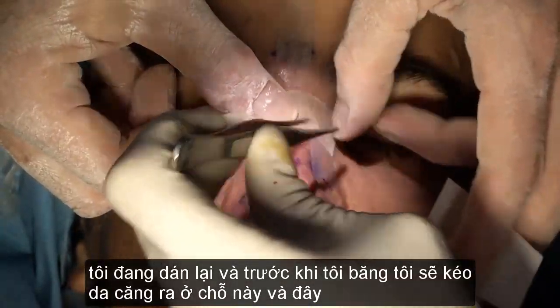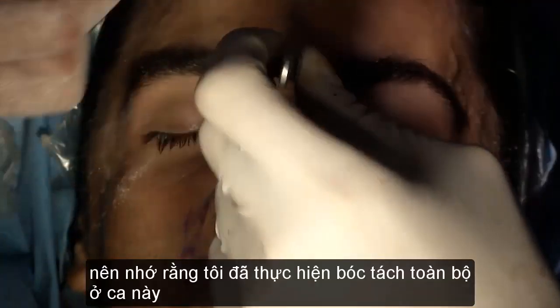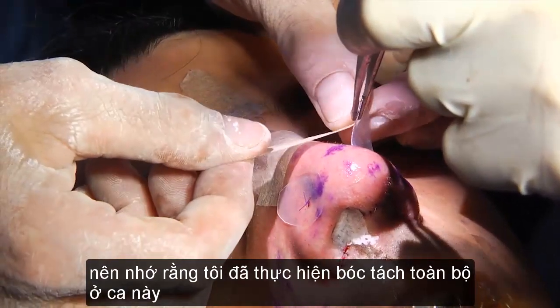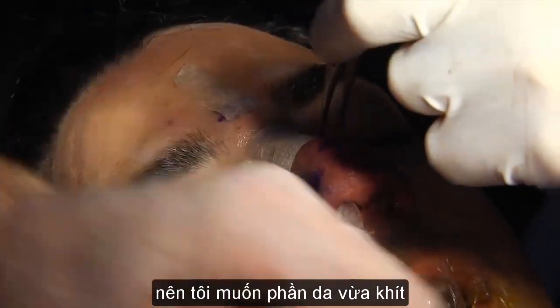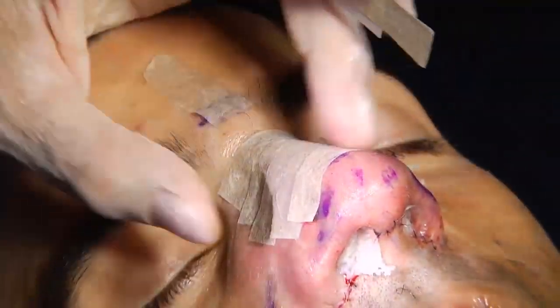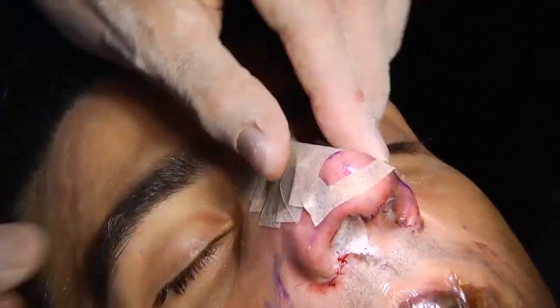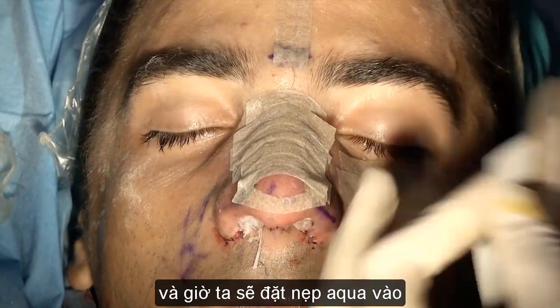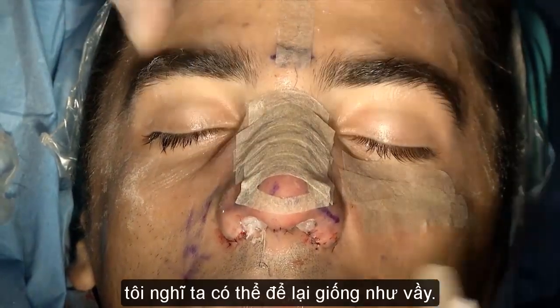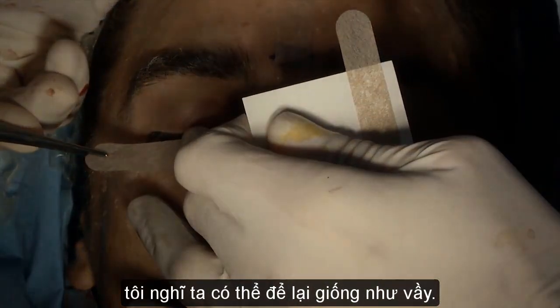All right. I'm just taping, and before I tape, I will get tension on the skin here and here. So remember, we did full degloving in this case, full degloving. And so I want the skin to adapt. So now we will put the aquaplast. And I think we can kind of leave it like this. All right, Nate? Yeah. Good.